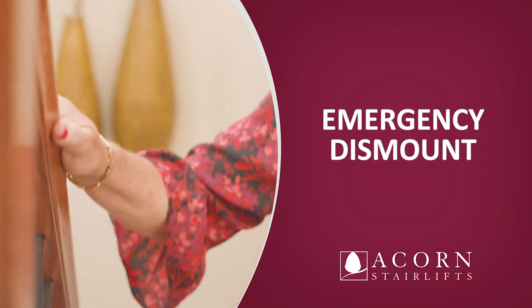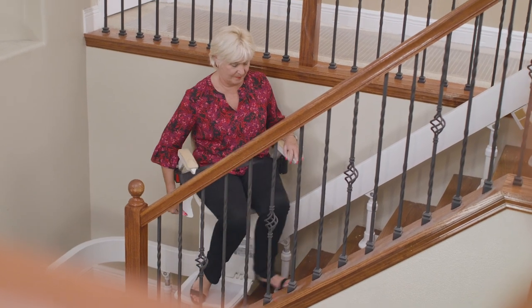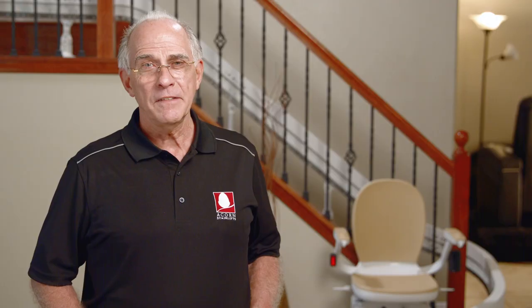Emergency dismount. If you must disembark mid-travel for any reason, turn the seat depressing the seat's swivel lever, allowing the seat to face the staircase. Release the paddle and lock the seat in place for a safe exit. If the stairlift fails to operate, please remain calm and alert others before attempting to disembark the stairlift.